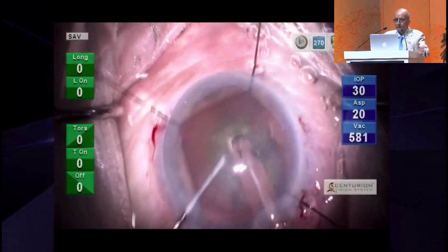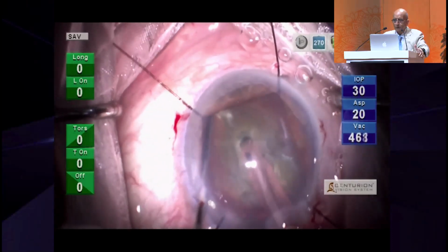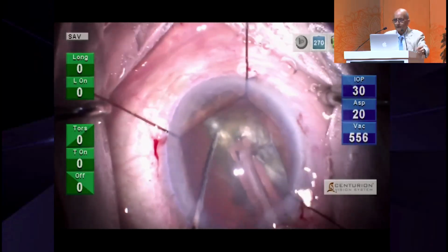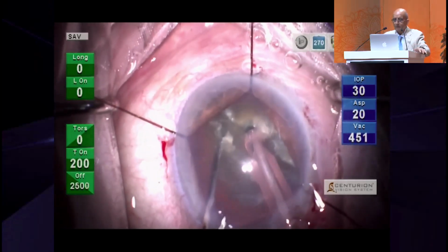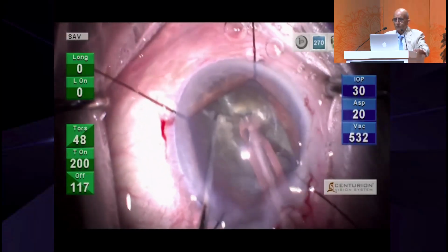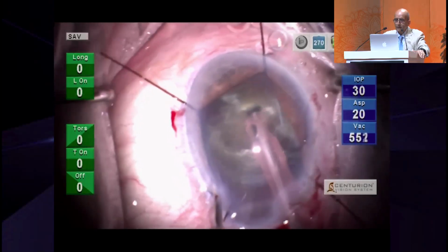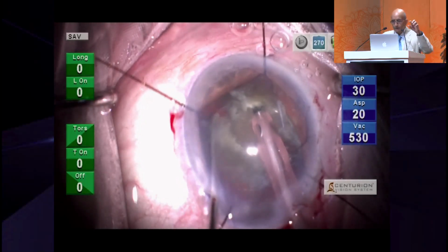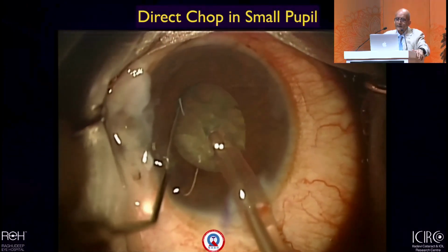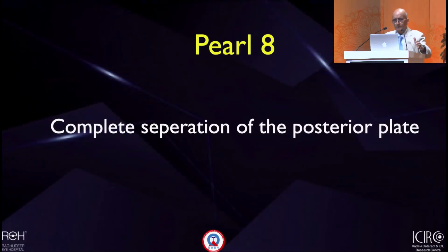You may have to have whatever expansion device you have, but same thing, you can do the horizontal chop in this cataract. It is a little more effective than what I showed earlier, but the safety margin is a little reduced in this technique compared to the one where you chop in situ step by step. But now you can impale this tip once again in the depth and bring the chopper there. You can do it in a small pupil like the other one. It depends on how much practice you have in a particular action.